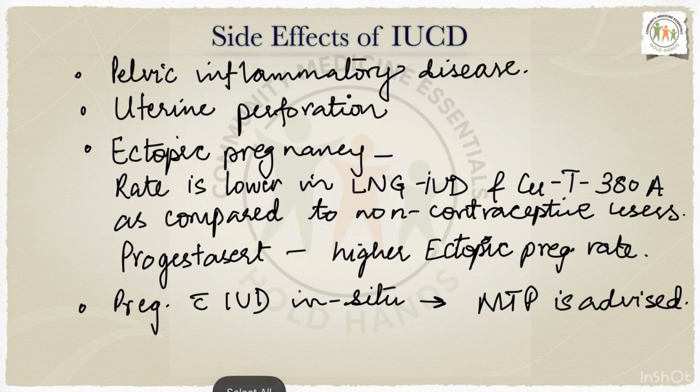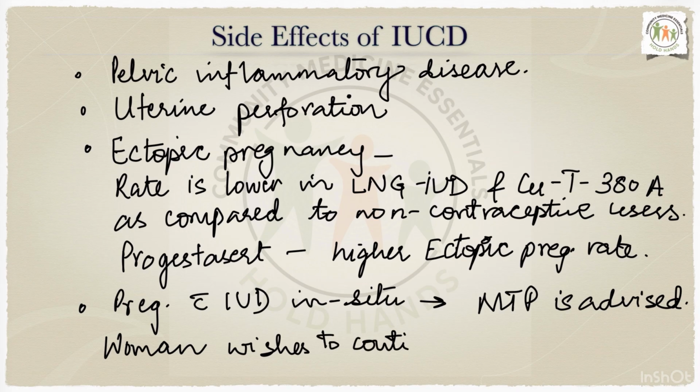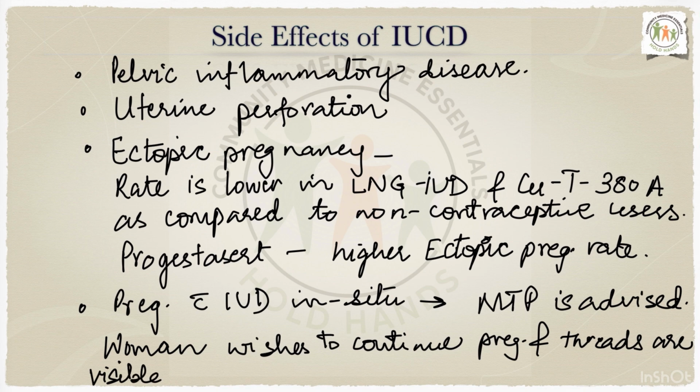But if the woman wishes to continue pregnancy, and threads are visible, IUCD should be gently removed.